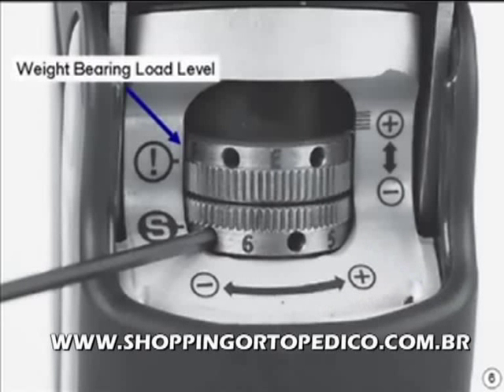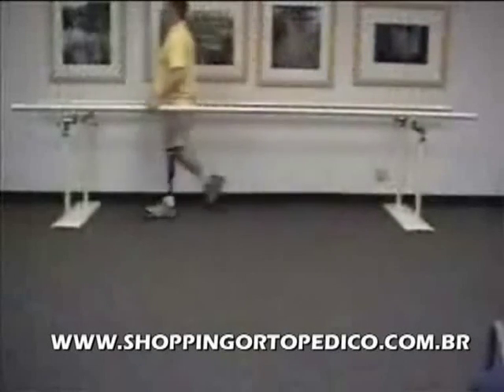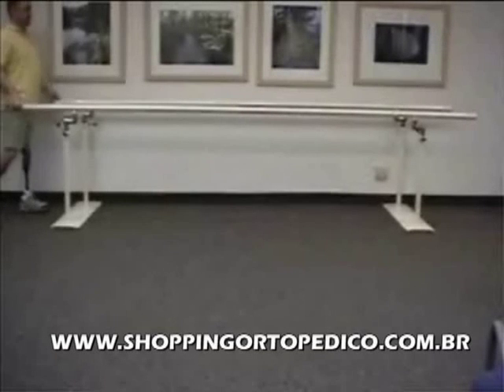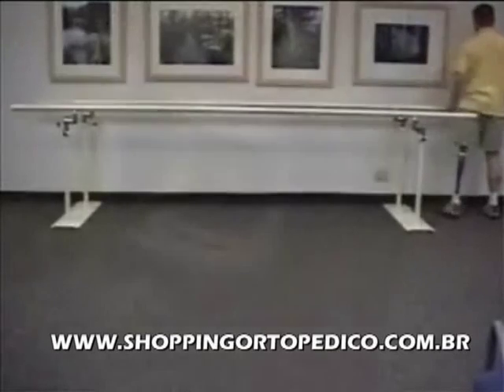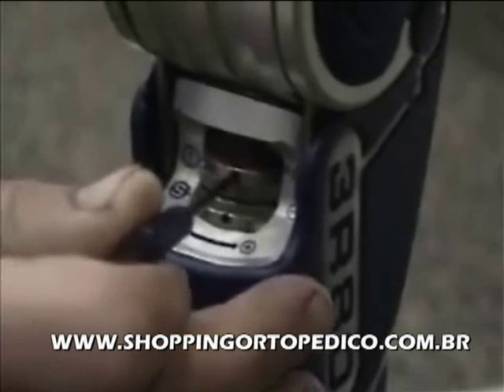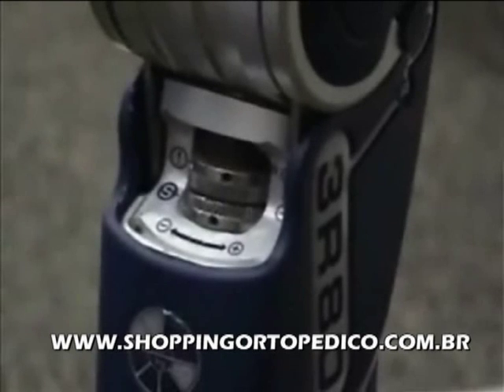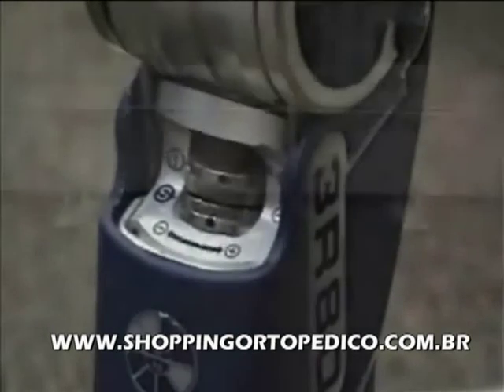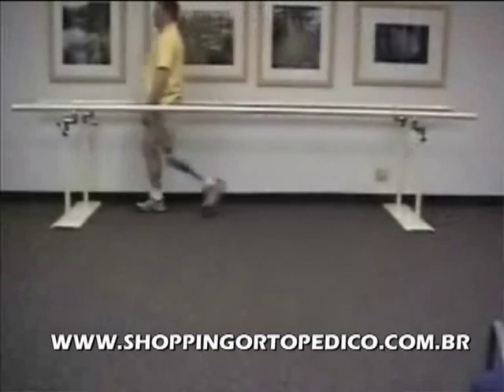The weight-bearing load level is set to a very low level at the factory so that it is very easy for the patient to engage the stance. Have the patient walk and observe the disengagement of stance. This should happen at terminal stance, and if the threshold is set too low, the stance will not disengage properly at terminal stance and the knee will tend to catch. If that is the case, turn the upper ring to the right to increase the threshold. Do this in small increments to ensure that the stance flexion damping is still properly engaging during loading of the limb. Have the patient walk again and recheck until the stance consistently disengages at terminal stance.